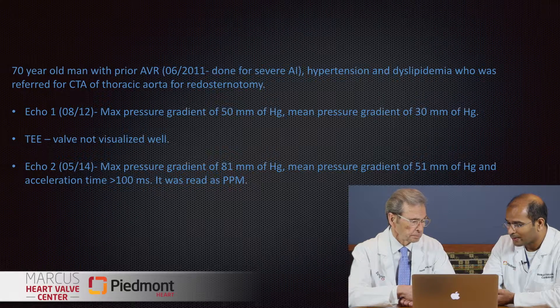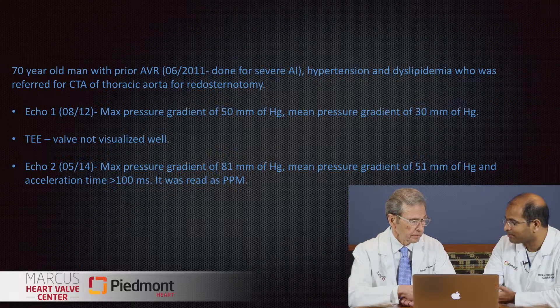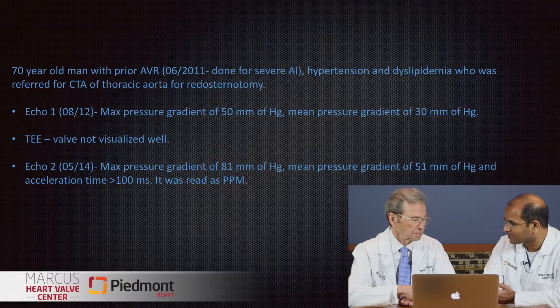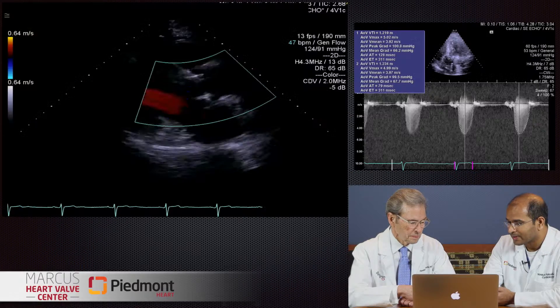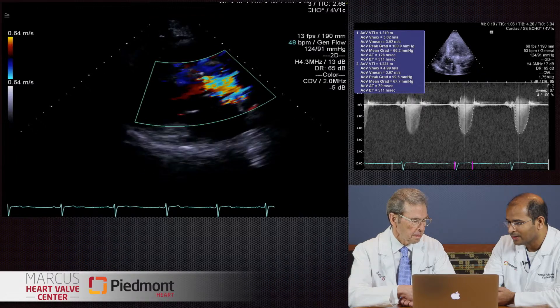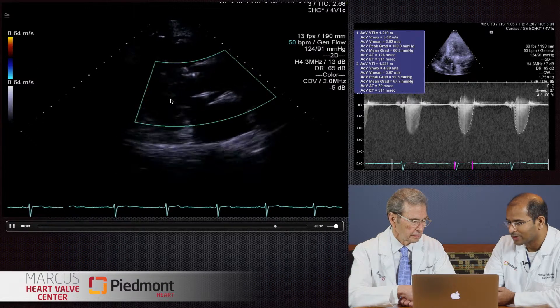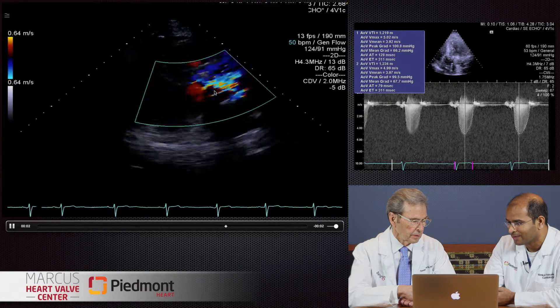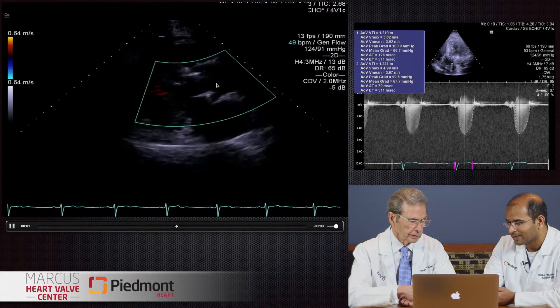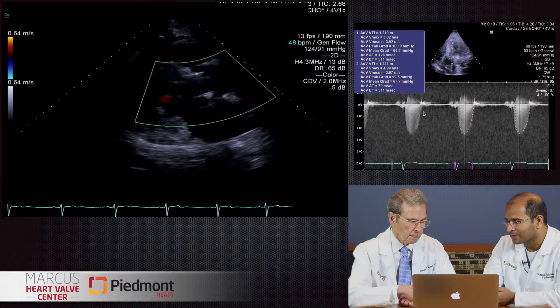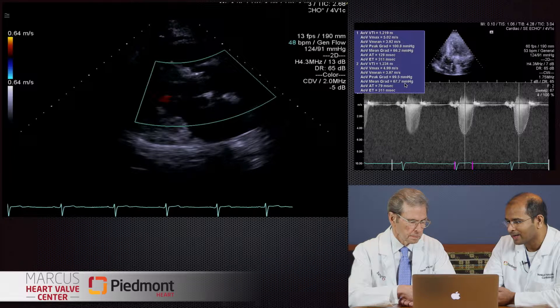He had a follow-up echo done in 2014 with mild symptoms. His max gradient was 81 and mean gradient was 51, and his acceleration time was greater than 100 milliseconds — it was read as patient-prosthesis mismatch. Looking at the parasternal long axis with color, you can see flow acceleration along the LVOT across the valve, a lot of turbulence. The continuous wave Doppler from the apical long axis view shows high velocities greater than four, a high mean gradient, and acceleration time that's very prolonged — about 128 milliseconds.